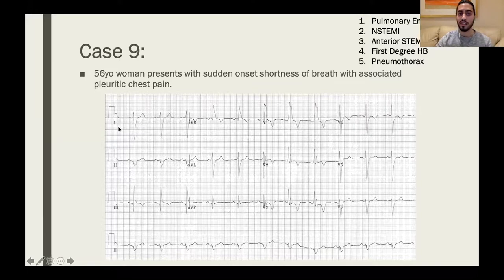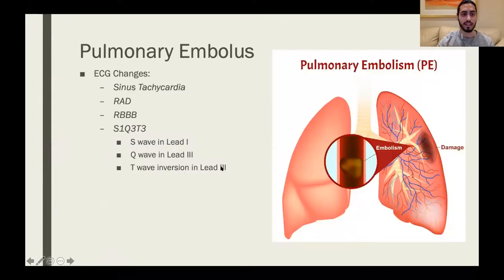And it is a classic examinable sign of someone who's had a pulmonary embolus. It only happens in about 10 to 20% of patients, but examiners love it. So just remember the sign. Classic ECG changes in a PE.